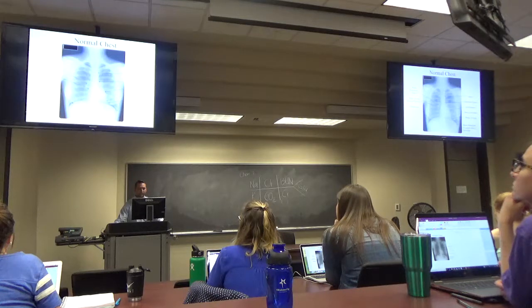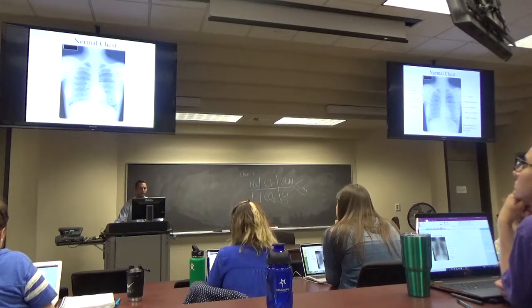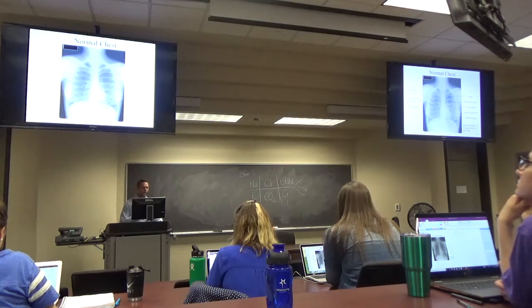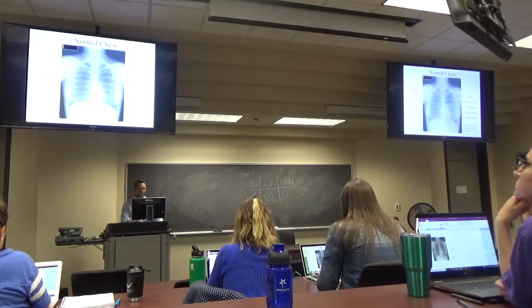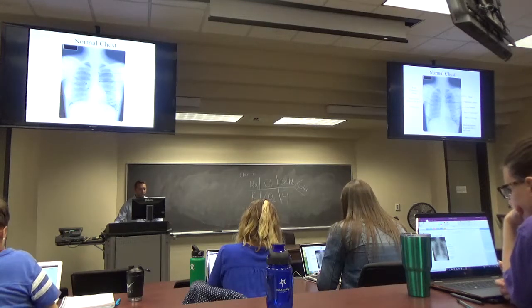And then we have the left atrium, left ventricle, but remember the left ventricle, you only see a little bit of it because the right ventricle is superimposed over it, because it's in the front, and the left ventricle's in the back. So when you have left ventricular hypertrophy, the left ventricle gets big and it comes over more lateral. When you get right ventricular hypertrophy, it comes more anterior, okay? Because that's kind of the situation of those two.